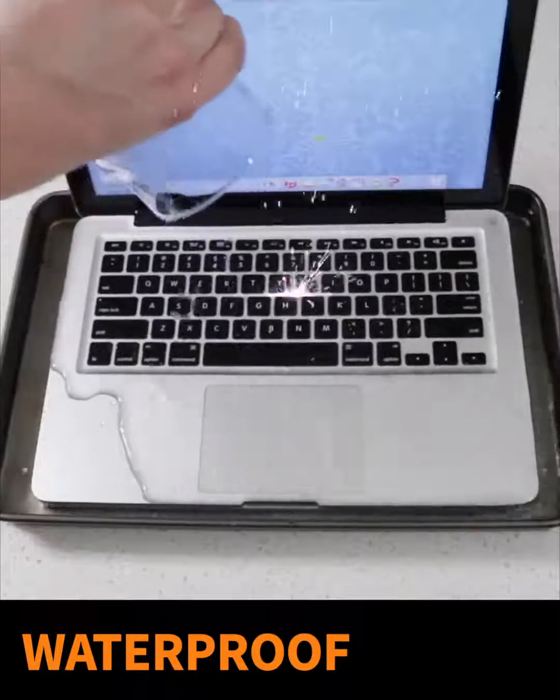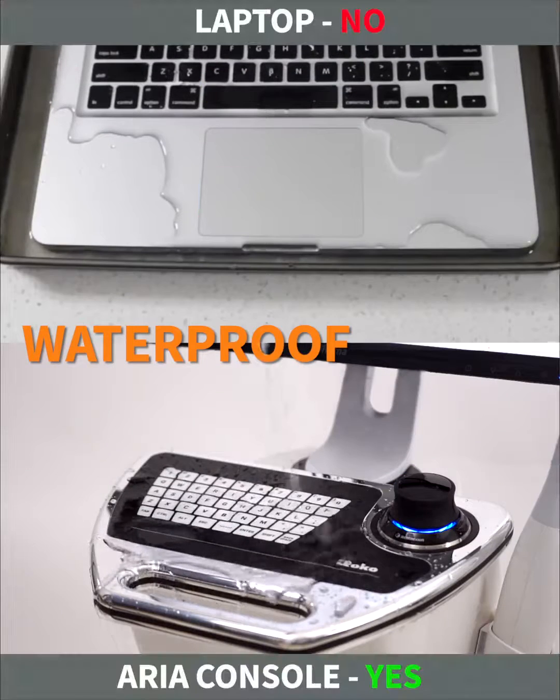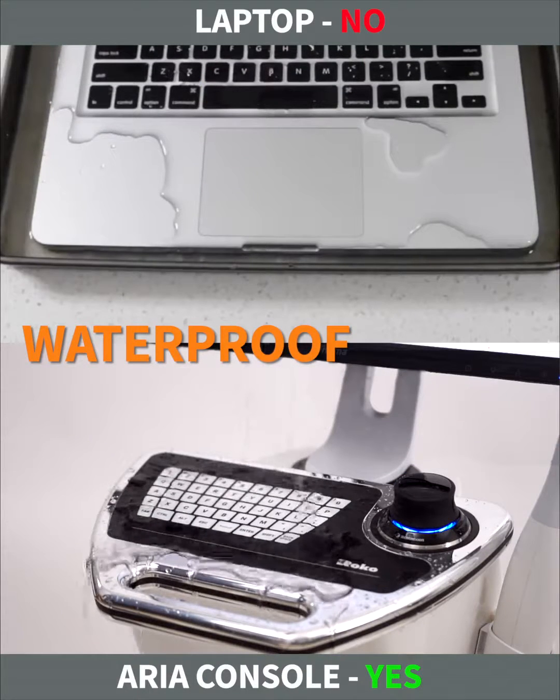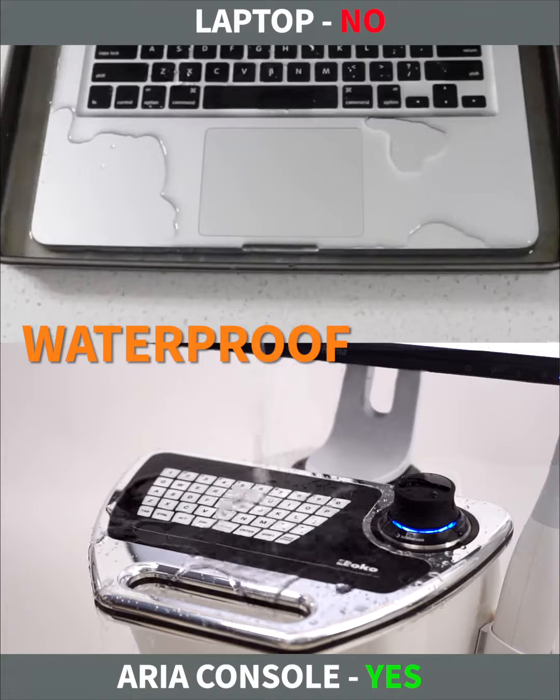In your lab, water is simply everywhere. It is spread easily, so a patient or a dentist's assistant can pour water on the PC and damage it by mistake. It's different with a console — Aria consoles are water-resistant.